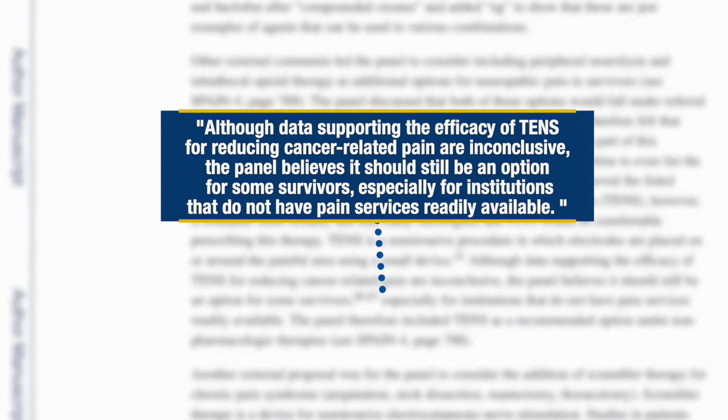For managing the pain associated with knee osteoarthritis, data are conflicting. A 2009 Cochrane review found that the evidence was inconclusive based on the poor methodological quality of most studies, which usually had small samples of participants and were very heterogeneous in their protocols. But in one large multi-center trial including 203 patients, no additional benefit was found for the outcomes of pain or function from either TENS, interferential currents, or shortwave diathermy compared with sham interventions.